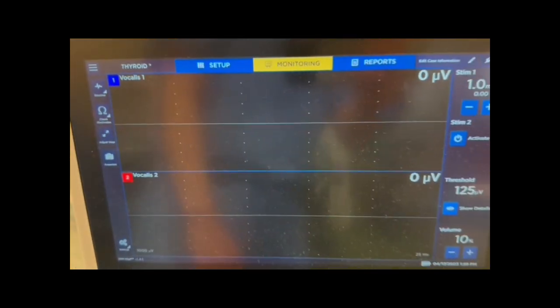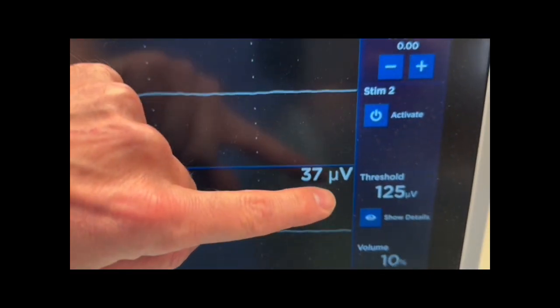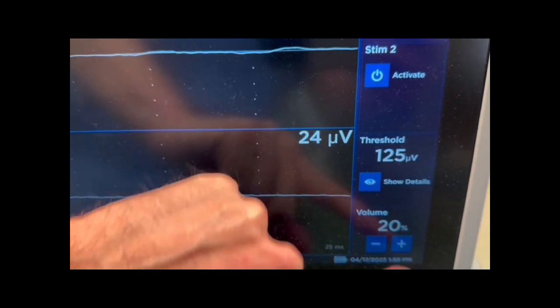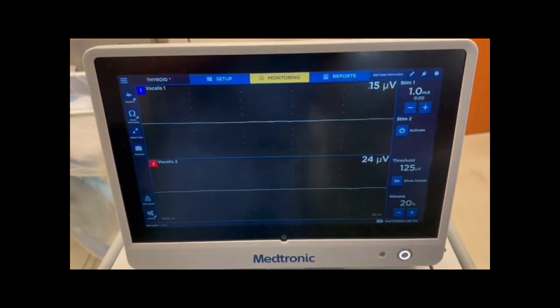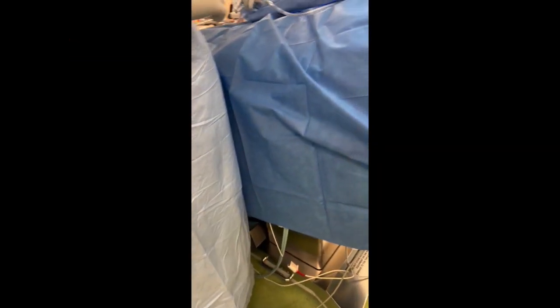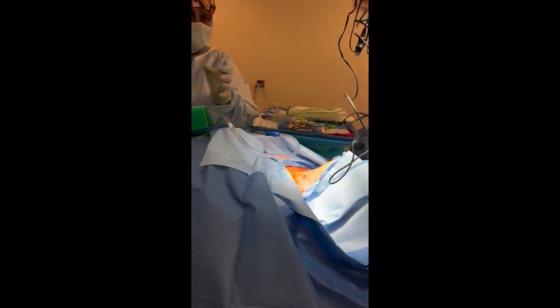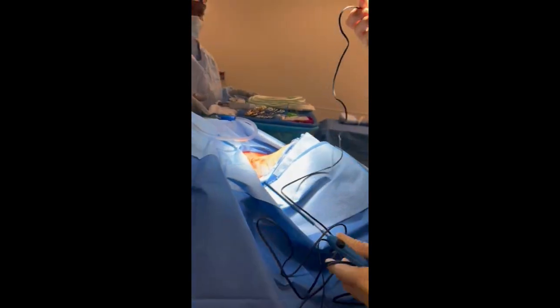This takes us to the monitoring screen. You can see the potentials have a little bit of background. You can adjust the threshold that defines an event, adjust the volume setting, and adjust the stimulus for how many milliamps touching the probe to the tissue provides. Once prepped and draped, you'll pass off the end of the lead for the nerve stimulator.